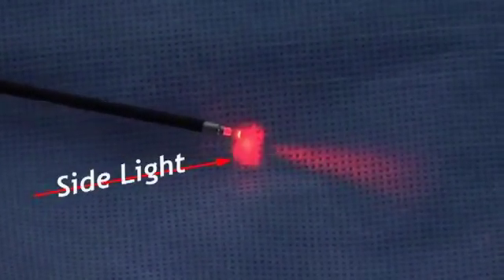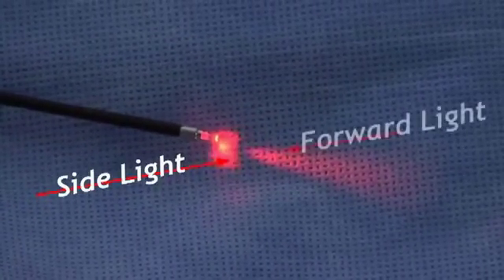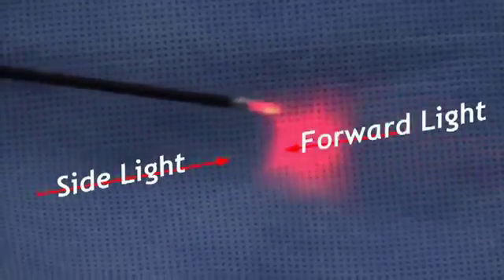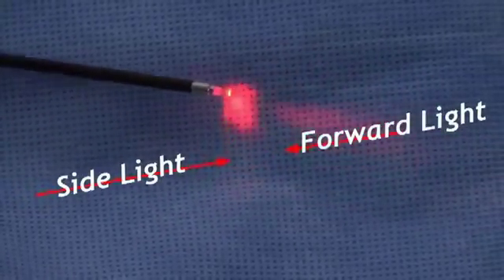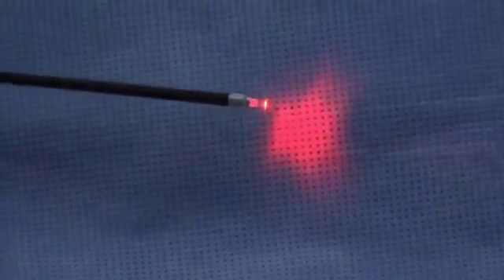I'm turning the handle, and I'm turning it in such a way that this is the laser firing down, and you can see that bright light, which is about 60% of the energy, and then you have some energy going forward as well, which helps us to move through the tissue. But this brighter one is what's doing most of the work to attack the cellulite.